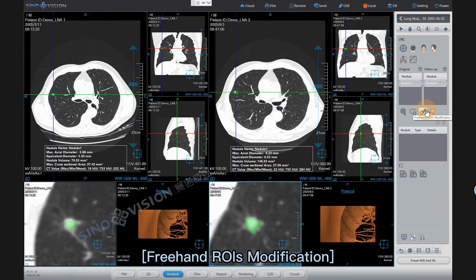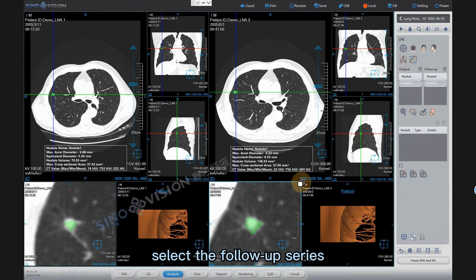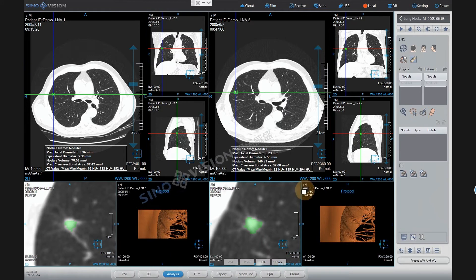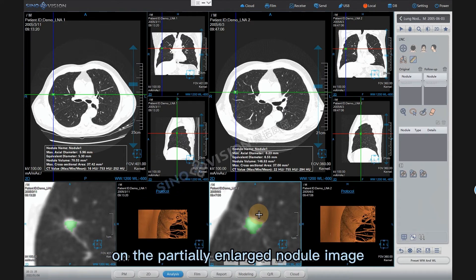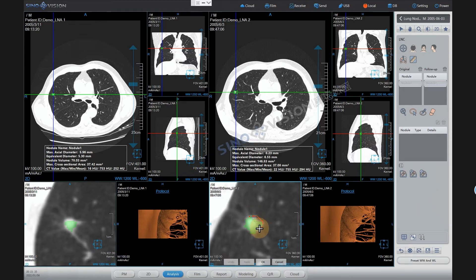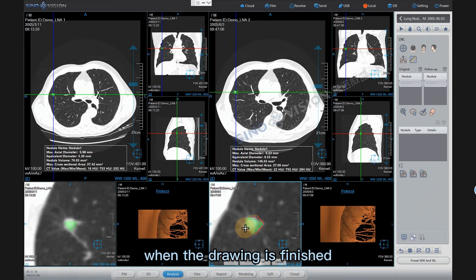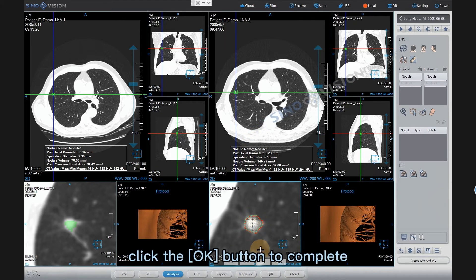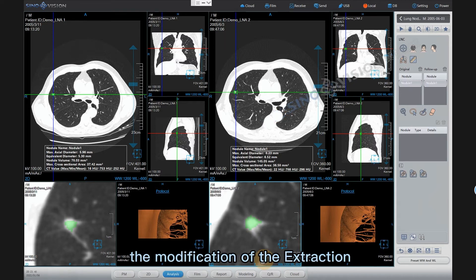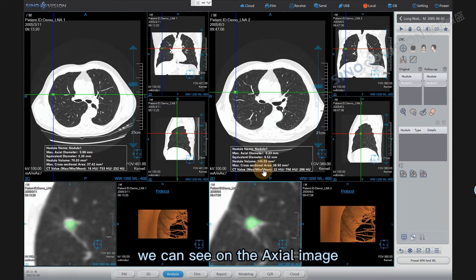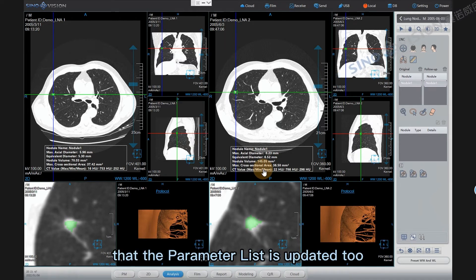Freehand ROIS modification: Select the follow-up series, then click the Freehand ROIS modification icon. On the partially enlarged nodule image, hold down the left mouse key to draw the nodule outline. When the drawing is finished, release the left mouse key. Click the OK button to complete the modification of the extraction. On the axial image, the parameter list is updated too.